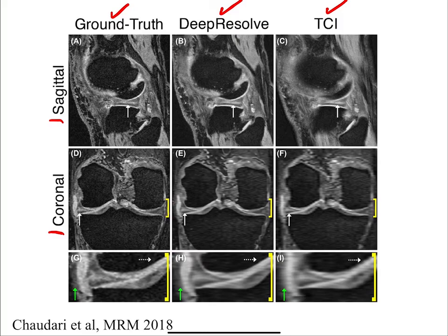This is some work that is being used for musculoskeletal imaging, and just showing that because of the nature of natural objects and images, you can really get away with acquiring less data, and then let the network figure out what should have been there, and in this case, you can go much faster then.